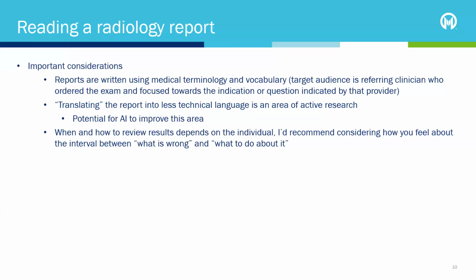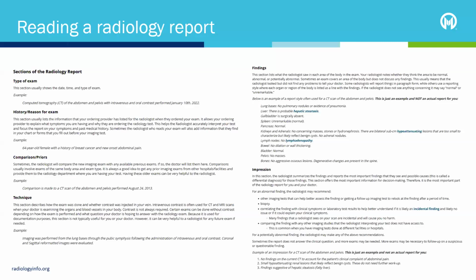Now, when you were talking about terminology and you showed us an example of a report, can you spend just a minute telling me your perspective of the terms that sometimes are confusing when I'm reviewing a report with a patient? Sometimes we state something as a lesion, and it's perceived as meaning it's benign because another area was called a tumor. So can you briefly explain some of the terms you use for abnormal findings when you're following a cancer status? Right. Yeah. And part of this is what I call medical jargon.